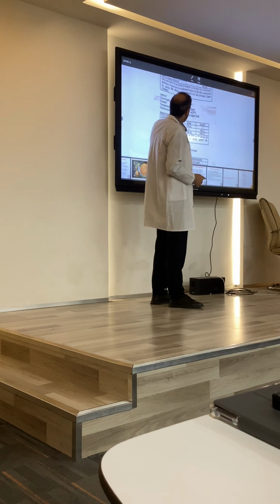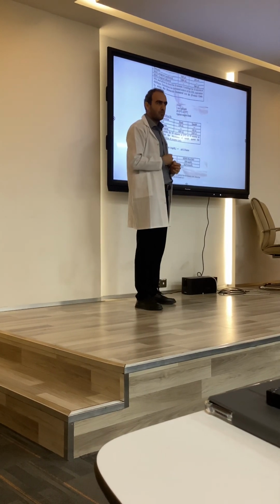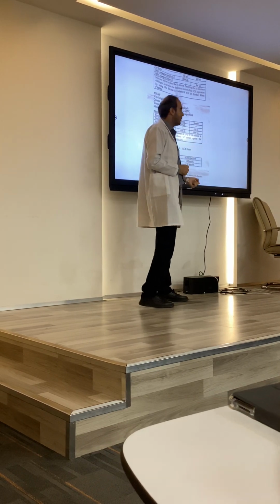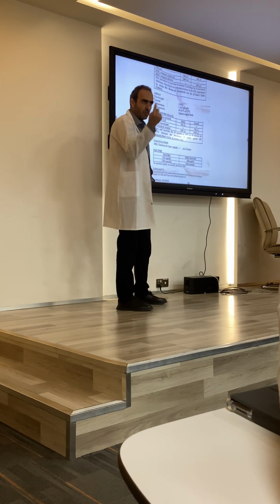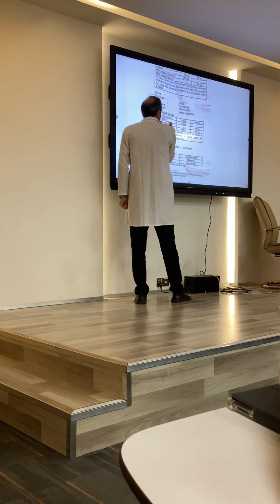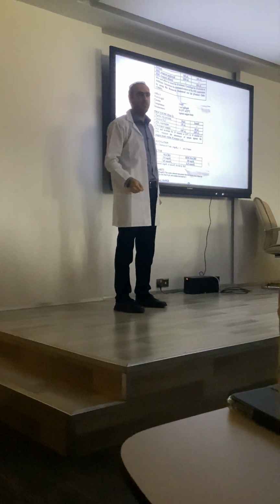For the next step, you need two tubes for HDL measure. One for blank, one for sample. For blank, you just add 100 microliter of distilled water, DW. For sample, you will add 100 microliter of supernatant from the previous step, which my colleague gave you.